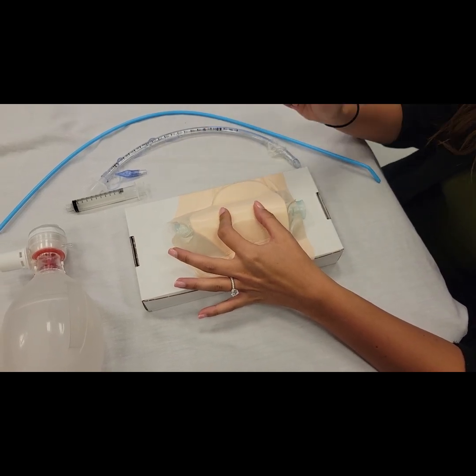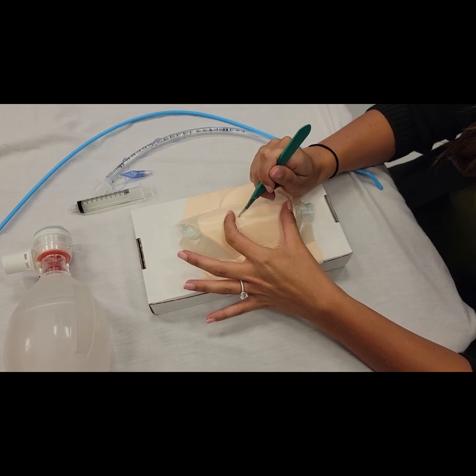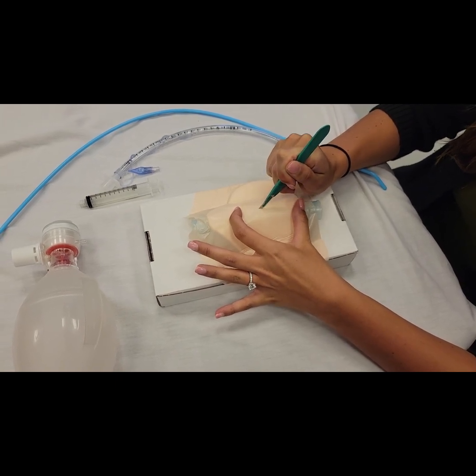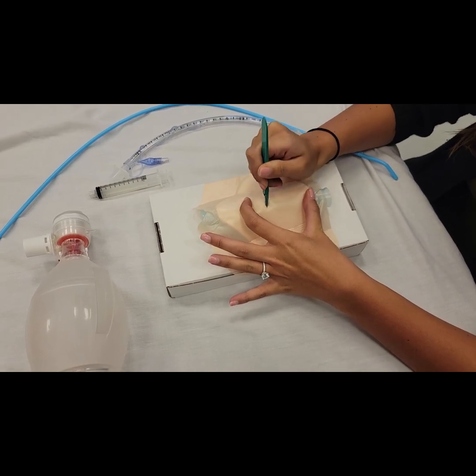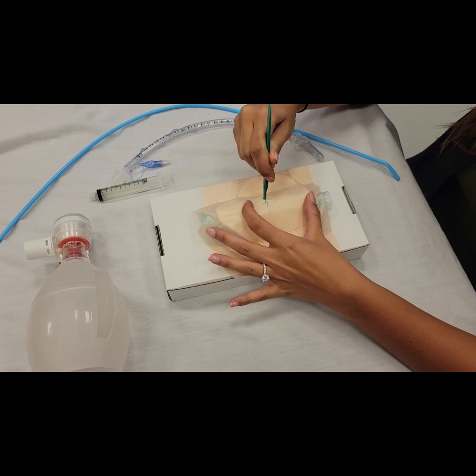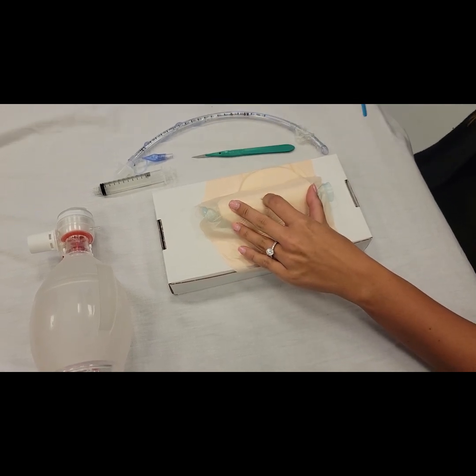grab your scalpel, make a vertical incision, and you can quickly twist, make a horizontal incision, and then put your finger in to not lose your landmark.